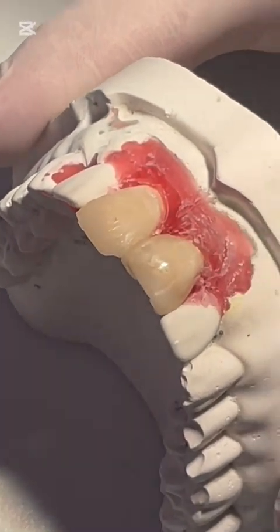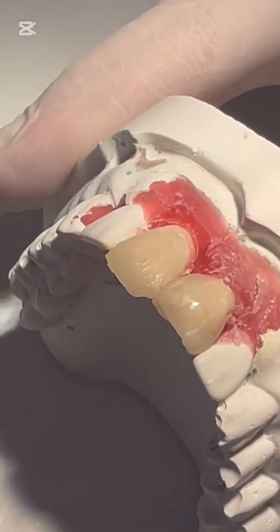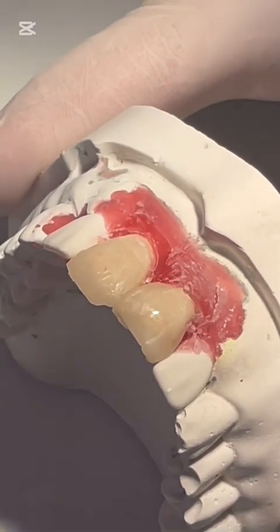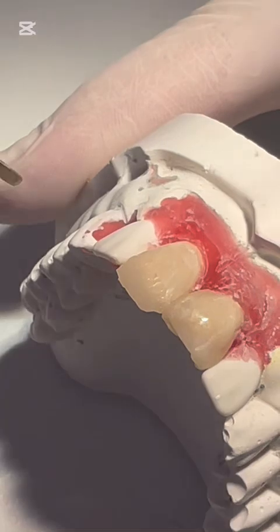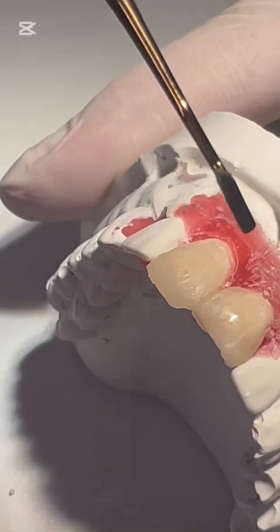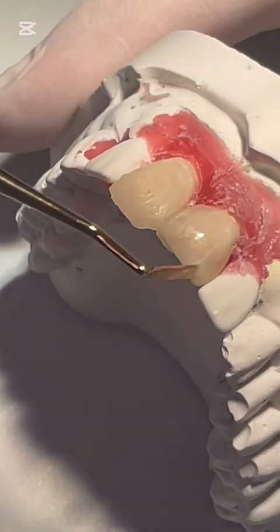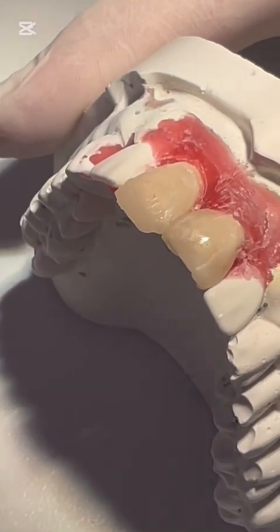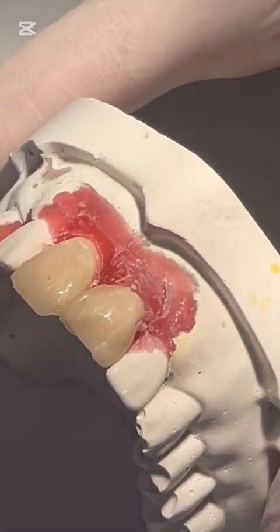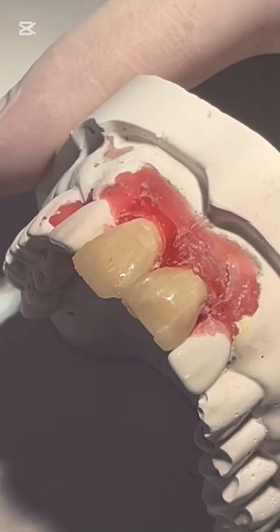Look at the difference now. Which one is more aesthetic and more acceptable? Right, the right one. And you can do this in the patient's mouth and say, look, if you want this result, I have to do this and this for you. If you are satisfied with this result, I can just add a little composite, and sometimes we don't close the diastema completely. We just reduce the diastema to make a more acceptable appearance, and this is a kind of camouflage treatment.